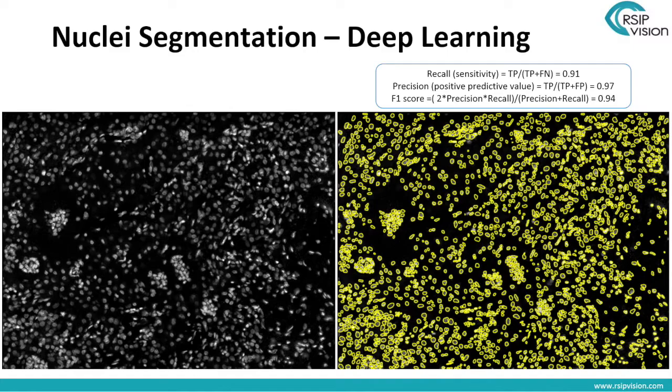How many cells have I correctly detected? How many cells have I missed? The way to do this, so there's a parameter here. You need to define some tolerance. You're not going to detect each and every cell at the same central pixel as the ground truth cell, but you can define some reasonable tolerance. You can measure afterwards how well your results have obeyed this tolerance. And then you count how many cells of the ground truth have I detected, say, to within 1 or 2 or 3 pixels. How many cells that the network has detected are being missed, and then you get your precision and recall numbers.